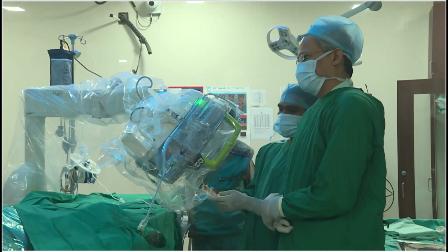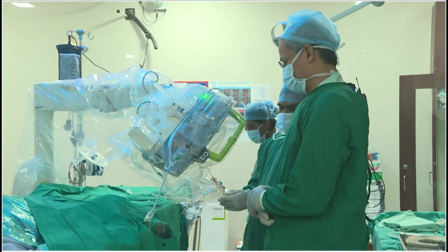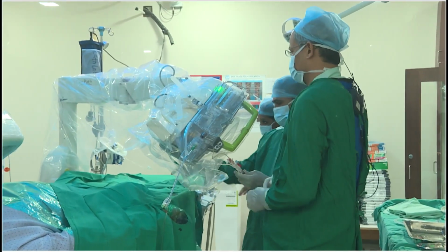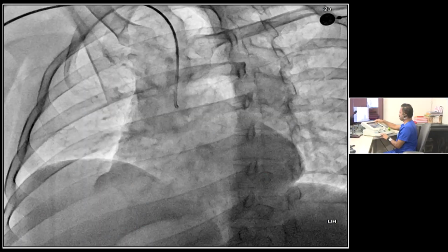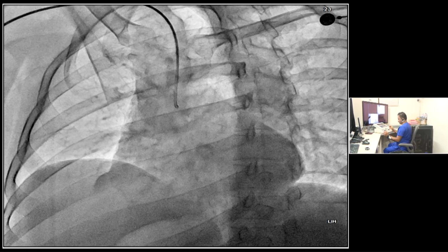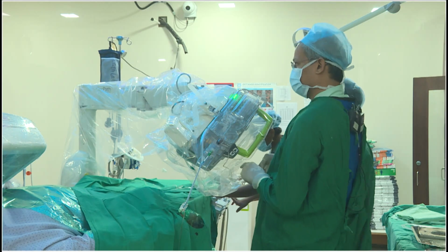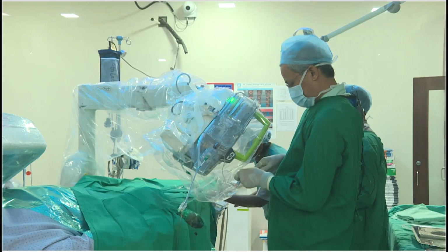Over to you, sir. Now Amit showed you how the catheter is connected to a cassette, and now this is the screen where you can see a catheter, guide wire and device. You can enable all, and that's how you can now see there is a screening catheter. We'll take a catheter down. Now this is the catheter moving.